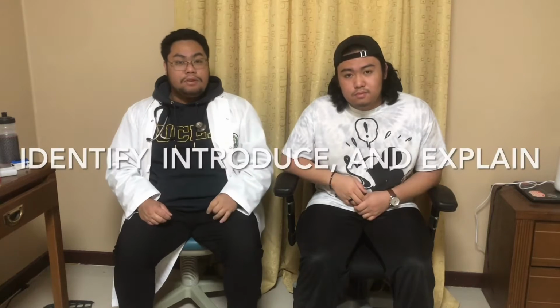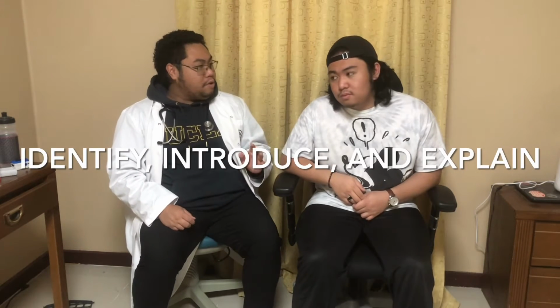After making sure that all the equipment is here, now we're going to identify the patient, introduce ourselves, and explain the procedure. So, good morning, sir. I'm your RT physician today. My name is Ryaan Gayak, RT-RP. May I know yours? My name is Gayak.